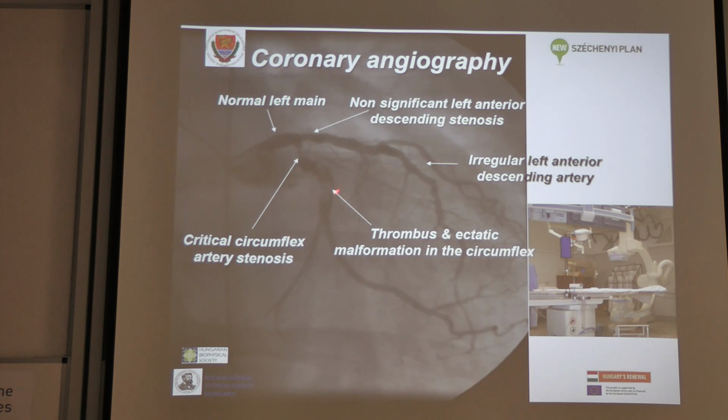But this is an acute or subacute phase of a plaque rupture, which complicates the long-lasting ischemic heart disease of that particular patient.